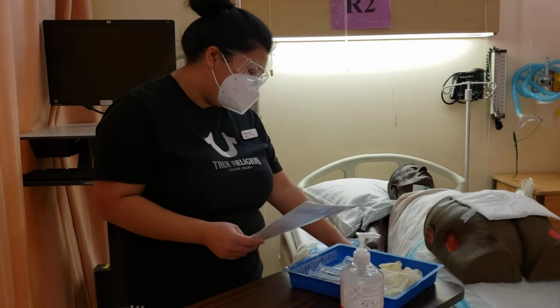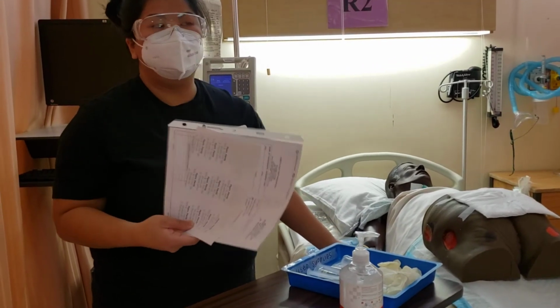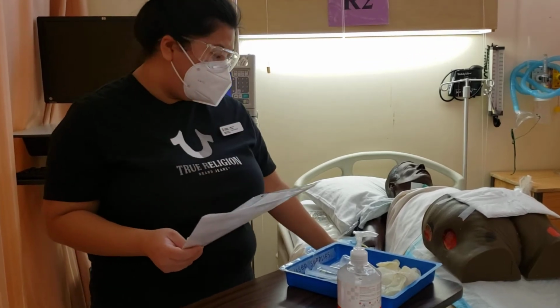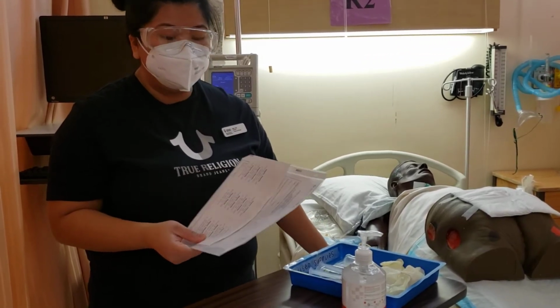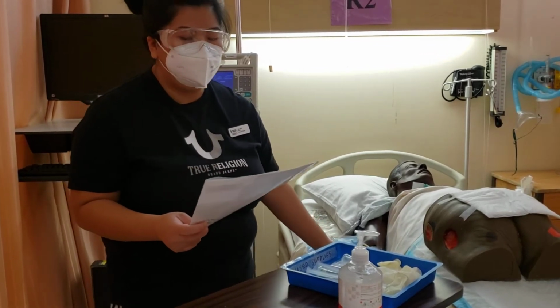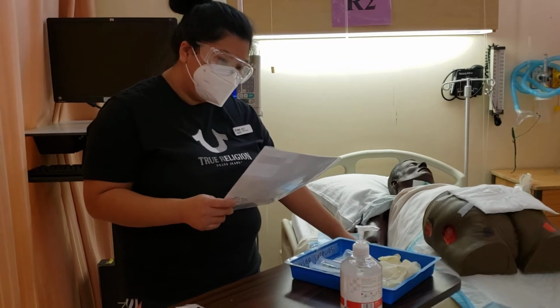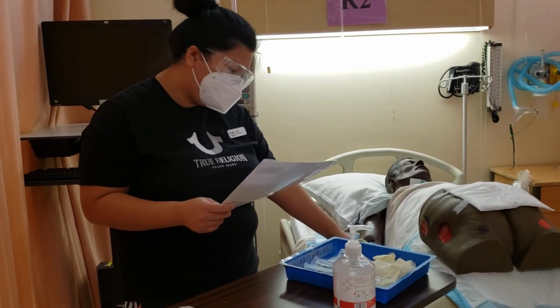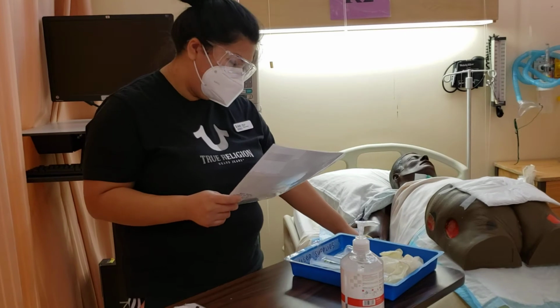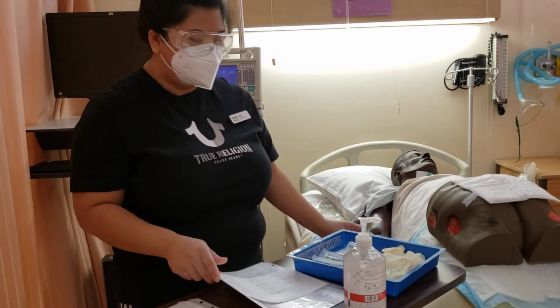Can you please tell me your name and date of birth? Mandy Myers. So I'm checking the armband, the requisition, as well as the blood tube labels for our patient's name and another patient identifier such as the FIN number to make sure we have the right patient. So Mandy Myers, and the FIN number is 123456789. Everything matches on all 3, so we have the right patient.